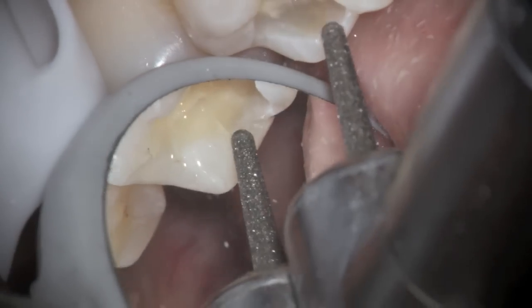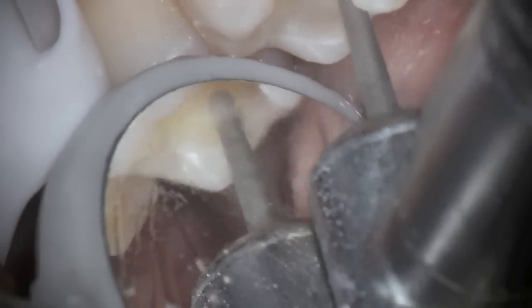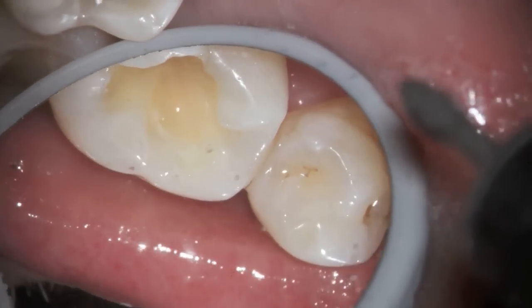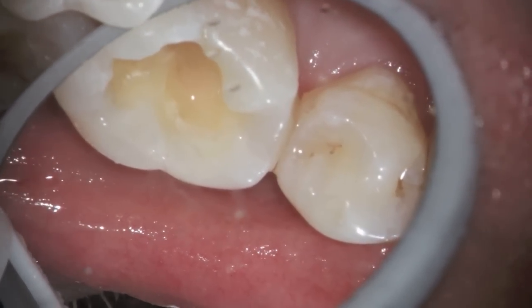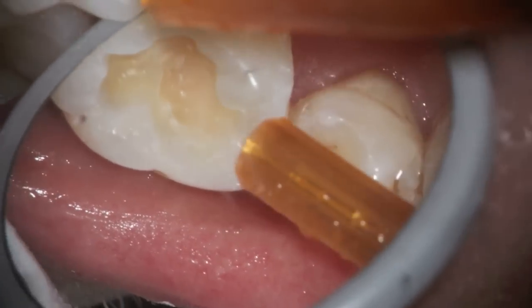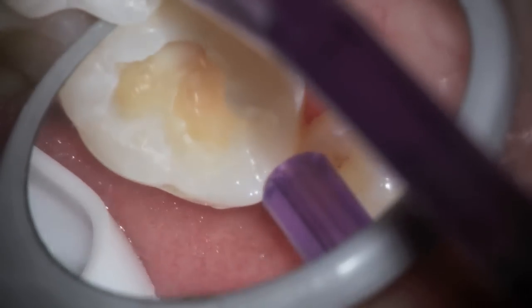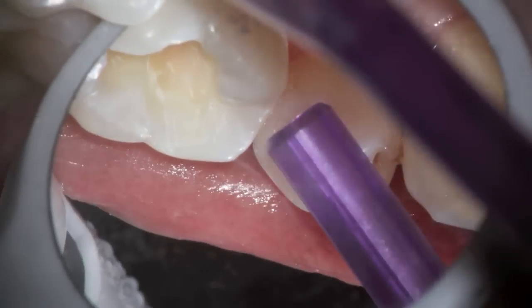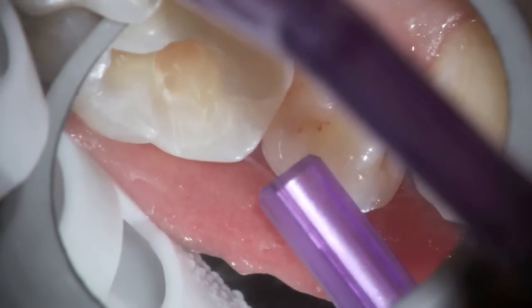Working on lower molars in particular, using a mirror to evaluate the drill and the area down there is very helpful. I take a look on the buccal side here and you can see that whitish area. I dry it, and sure enough there's composite there from before. If I left it that way I would just be leaving a layer of composite, so we go back and spend the time to remove it.